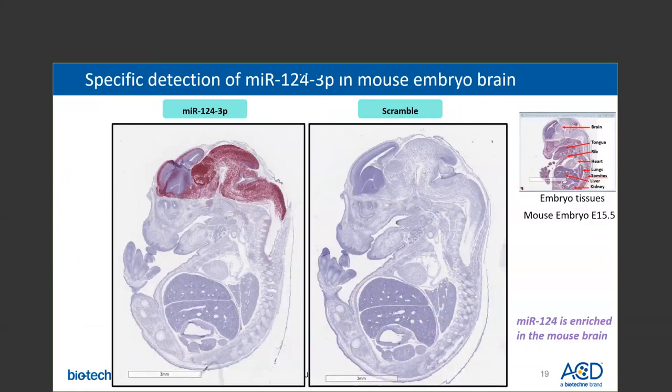This slide shows data of microRNA-124 detection in FFPE mouse embryo tissue. As you can see, microRNA-124 is detected predominantly in the mouse brain, but not in other tissues such as the lung, liver, and kidney, demonstrating the specificity of the probe and further confirming the northern blot analysis. Additionally, we used a scramble probe to further demonstrate the specificity of our new assay — the scramble probe is very clean in the mouse embryo tissue with no background.